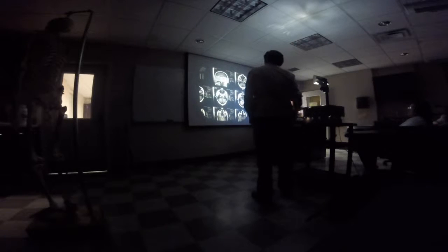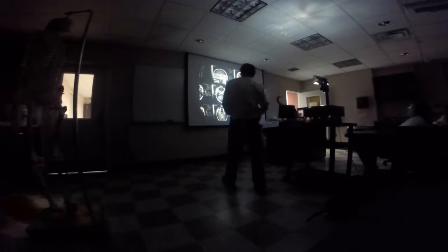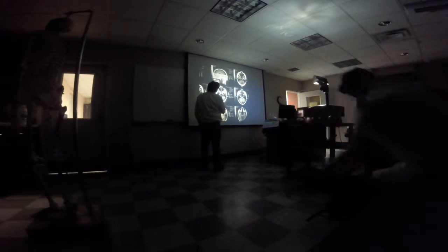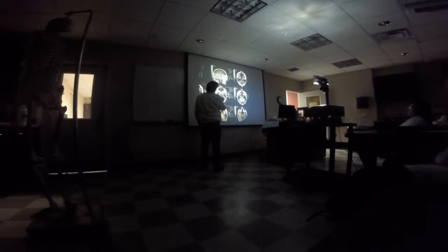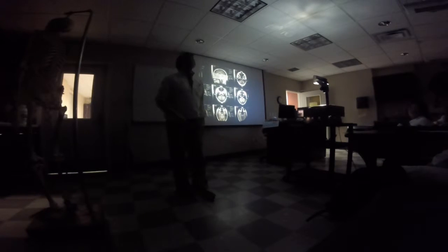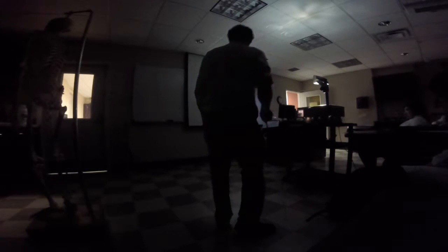It's very wide. By the way, when you look at an MRI, this will be the scout film here. With respect to all these other images, this shows you how the brain is being sliced. So these are going to be transverse images. Okay? And each one of these slices is going to represent one of these numbers. That's like how this model is set up. Yes. Same concept. That's right, same concept.